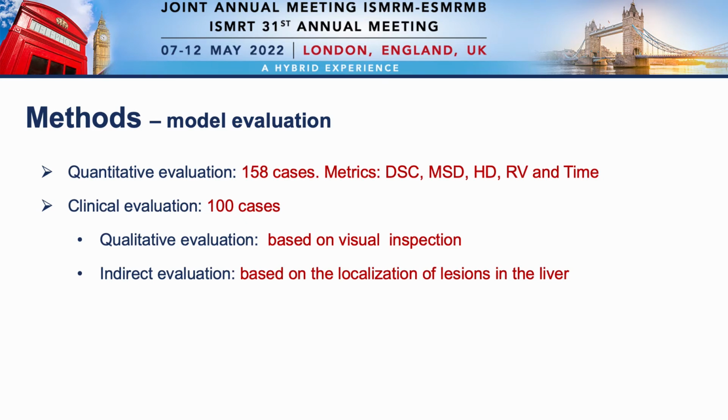Both quantitative and clinical evaluations were performed to assess the model. In quantitative evaluation, 4 metrics including Dice similarity coefficient, mean surface distance, Hausdorff distance, and volume ratio were used. Clinical evaluation was performed via doctors' visual inspection, and indirect evaluation was performed based on lesion localization.